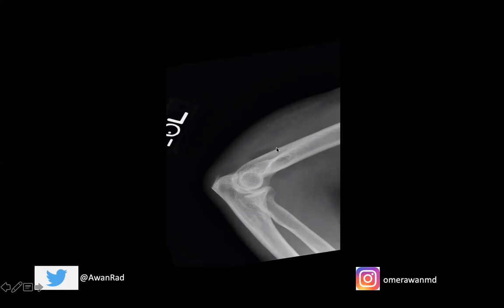We also have the presence of a posterior fat pad — again, a triangular lucency visible here. This indicates that there is a joint effusion. When you see a posterior fat pad, or enlargement and anterior displacement of the anterior fat pad, that indicates there is an effusion.